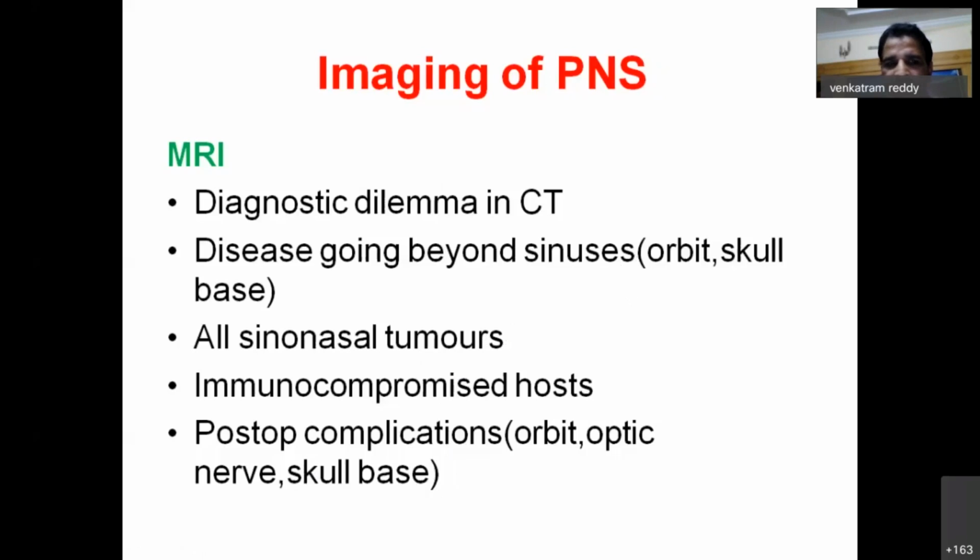So the CT scan is the basic investigation for us. But these are the indications where MRI can have a definite role to complement your CT scan in arriving at a particular diagnosis of the pathology and give an exact roadmap and plan for the treatment.